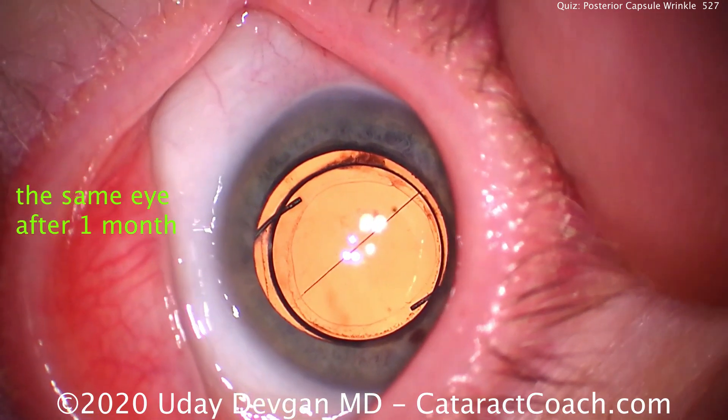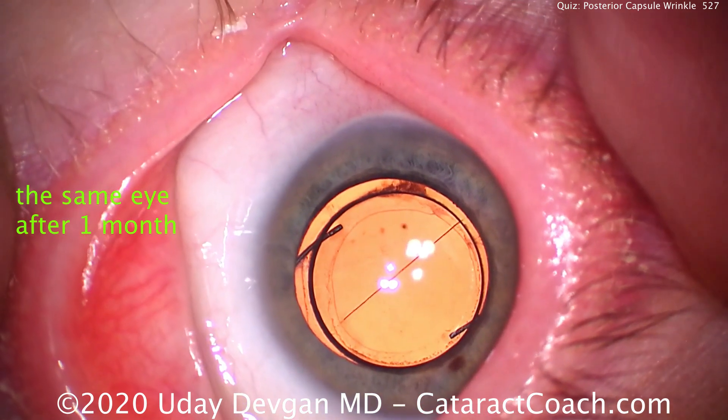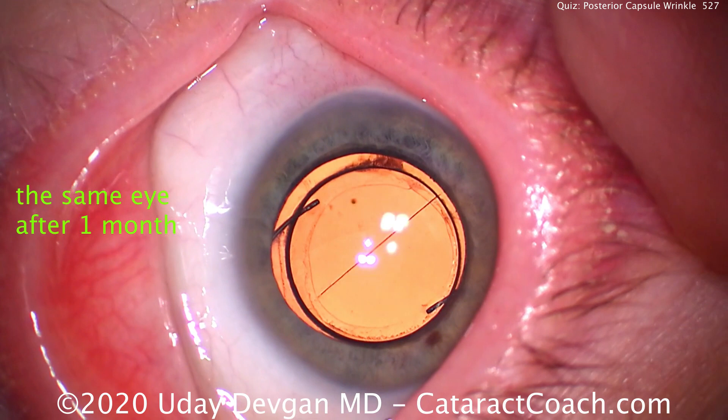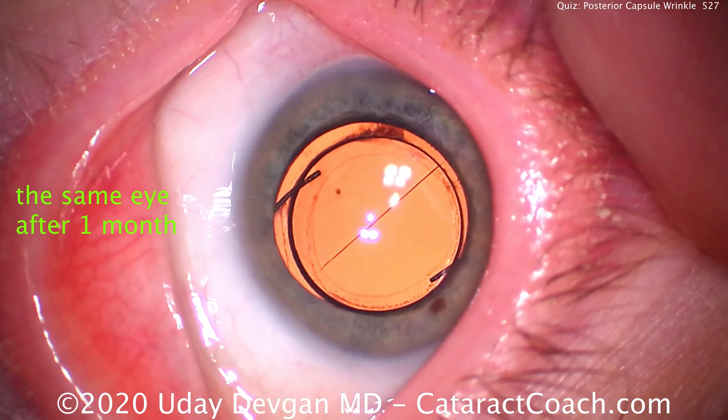Here's the same eye after one month — one month post-op. Again, there's that capsular wrinkle right down the middle. Look carefully. There it is.